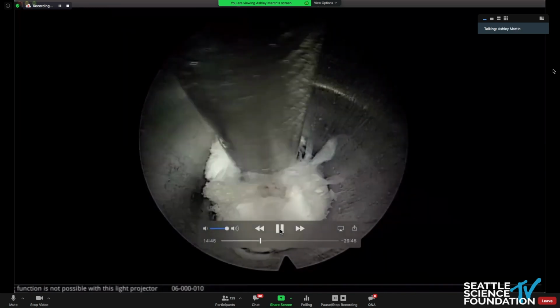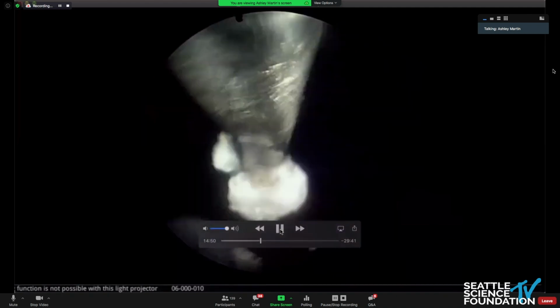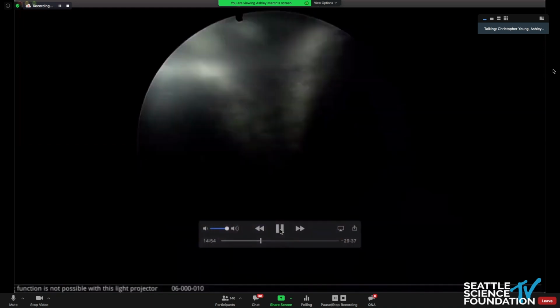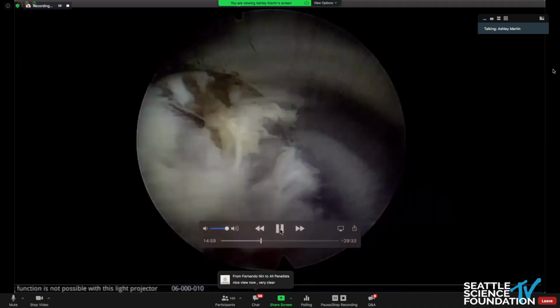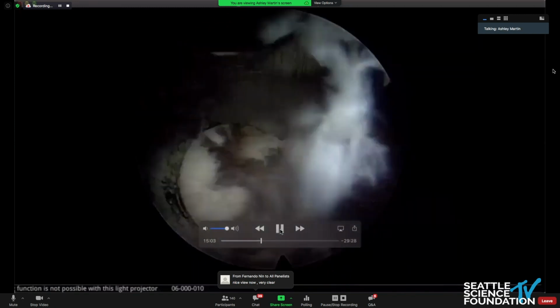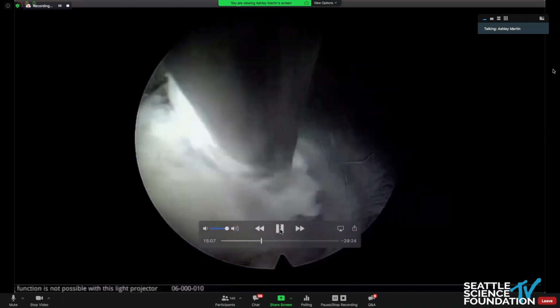Picture? Right there, right there. Okay, so now I'm going to pull this whole thing out. So that was probably the biggest piece. Probably the main culprit here. The herniation right there in the foramen. Right there at our entry point. It's nicely removed, unstable herniated nucleus pulposus.